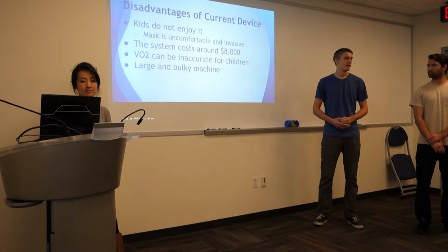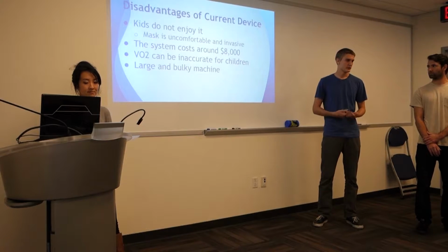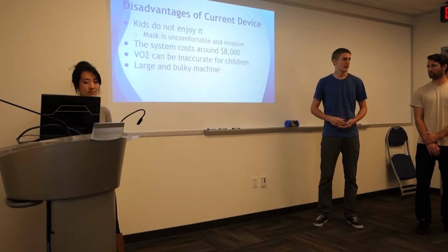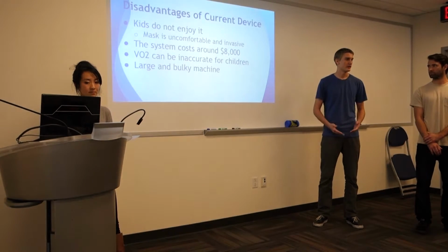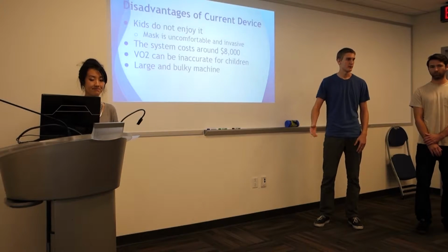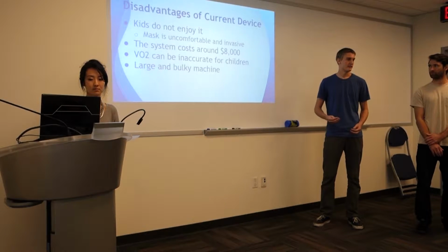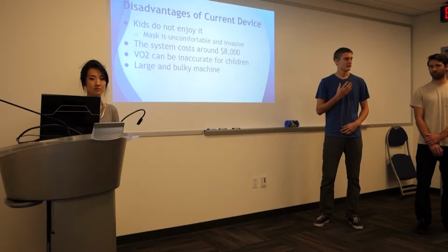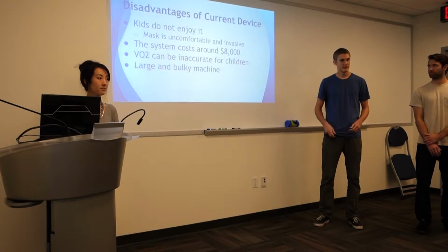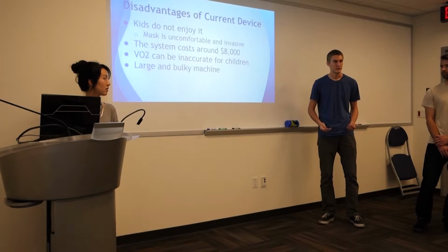For one, the whole setup costs about $8,000, and if we want pediatricians to actually do it when a child comes in, that's too expensive for a normal pediatrician to have, or to charge someone for a test. They won't do it. As well, the kids don't enjoy this test. They hate the face mask. It's invasive. So the kids just want to be done with the test and off the machine. They just don't try hard, they get off, and so they don't get very accurate results from it.